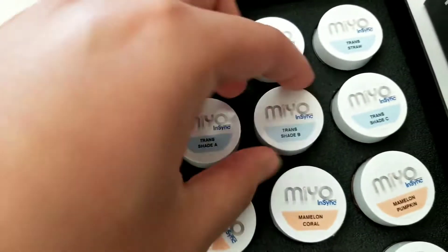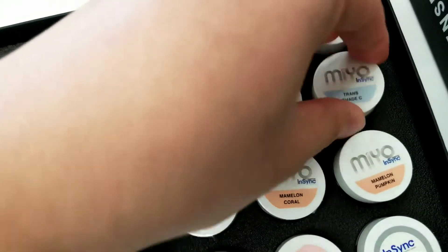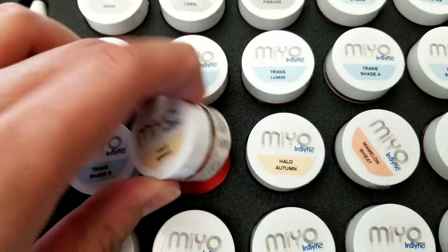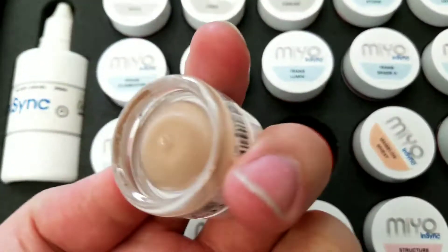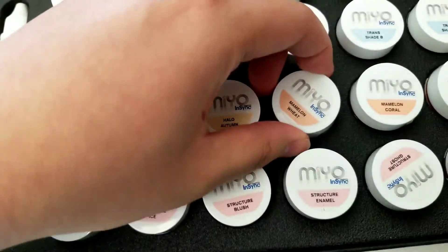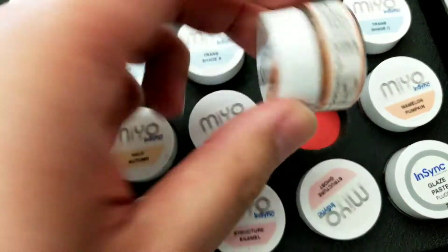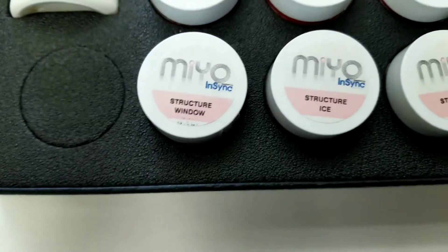You got your A, B, C, and D shades — these are for your halo effects. Halo Spring is for your more youthful look, and Halo Autumn is for your more aged mamelons effects. Wheat, Coral, Pumpkin — again, awesome names.